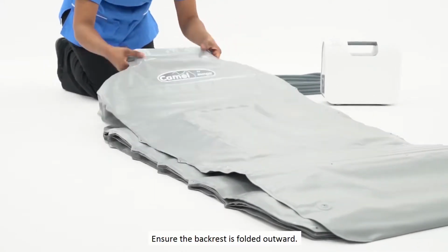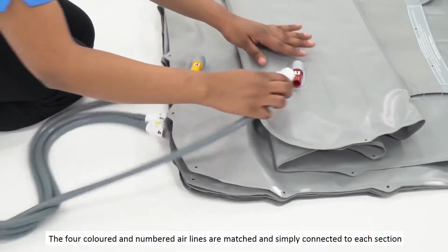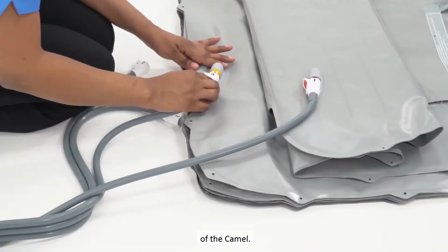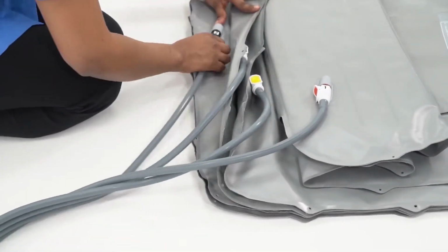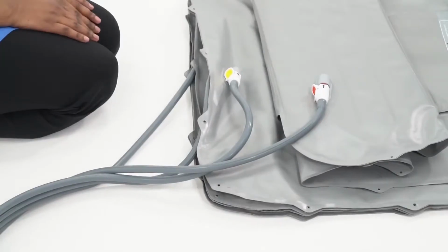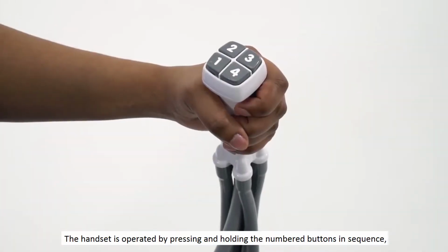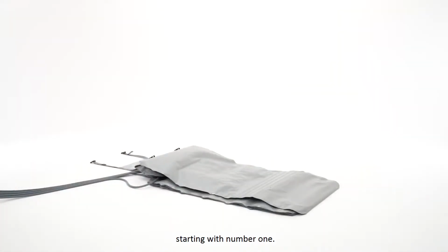Ensure the backrest is folded outward. The 4 coloured and numbered airlines are matched and simply connected to each section of the camel. The handset is operated by pressing and holding the numbered buttons in sequence, starting with number 1.